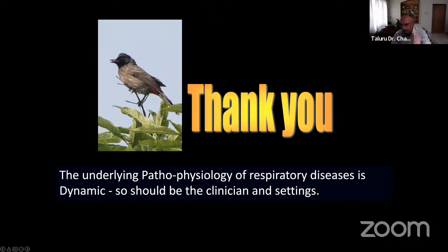But ventilators with flow trigger are expensive. If somebody comes and says so, don't get biased by what he says. You can always buy a pressure trigger with a lesser cost if you are in a rural setup.